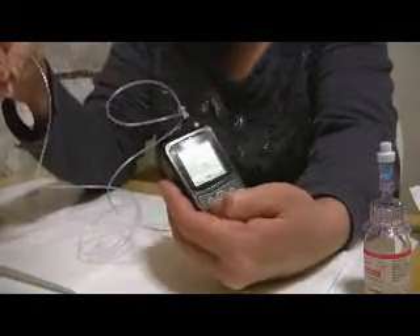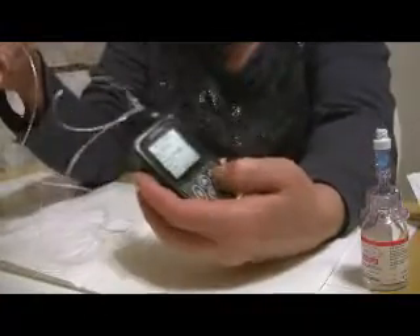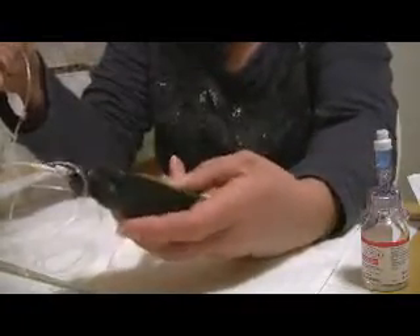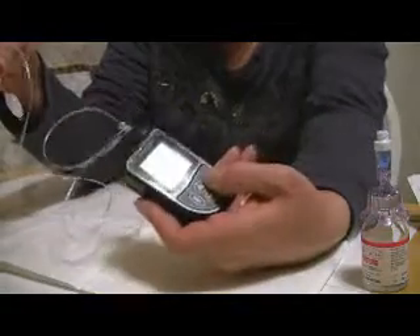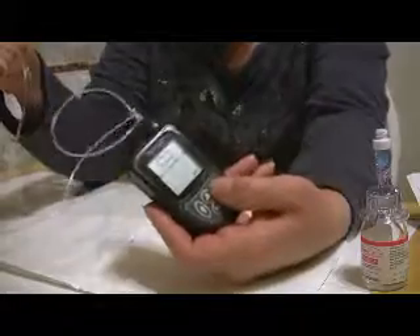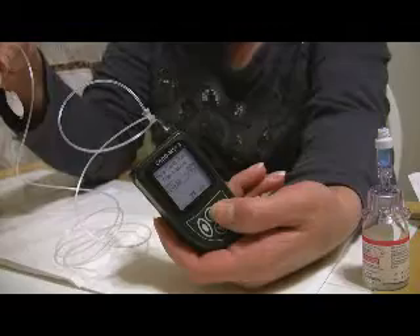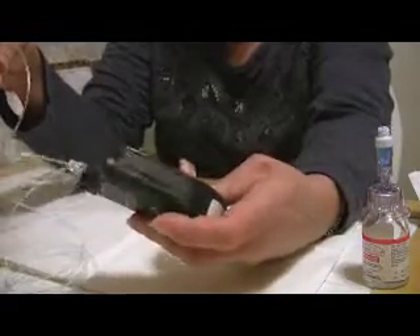We go back to the main menu and click on the button over here because we're done. The next option is to start your delivery, so we're going to go ahead and start the delivery. You always review the programs — it's always a continuous rate — and you just need to make sure that this is what your dosage is. You hit OK.